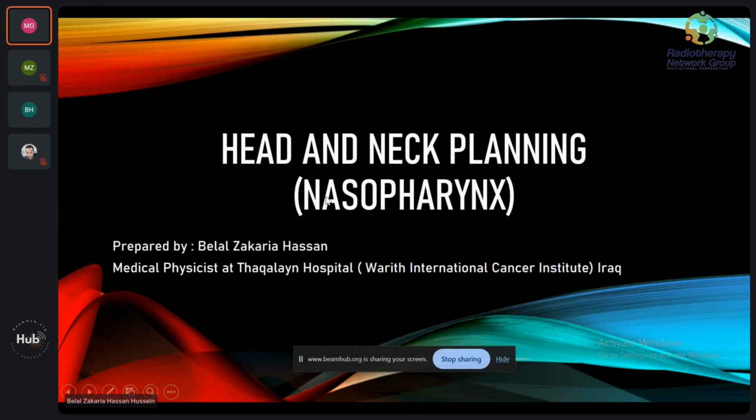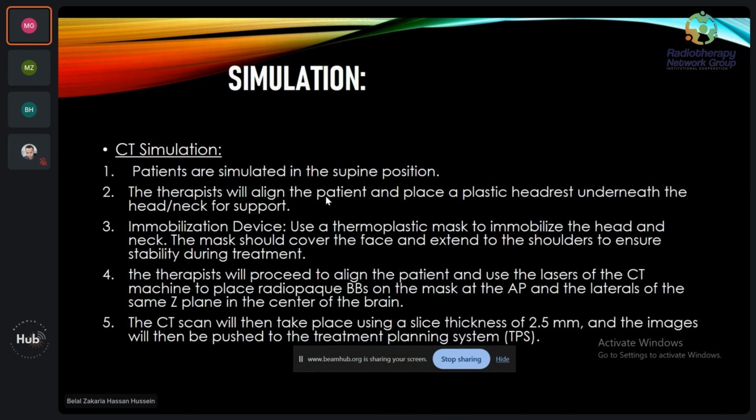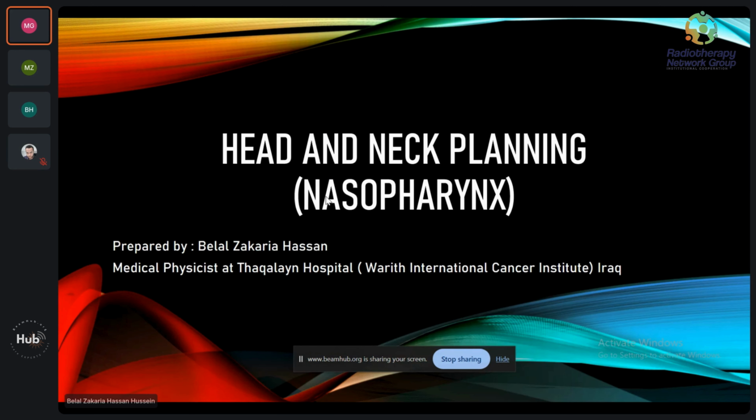No, no questions. Dr. May, I have a couple of questions, if you don't mind. Sure. So I see here you mentioned a 3 to 5 millimeter margin in your CTVs. Based on what do you decide what margin you are going to use? The margin is institutional, as you know. According to the setup errors, our physics colleagues could provide us with the margin they can to achieve a good planning.